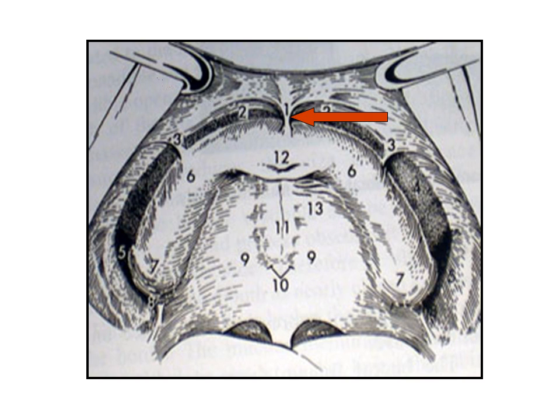The first of these is the labial frenum, followed by the labial vestibule, the buccal frenum, the buccal vestibule, the coronoid bulge, the residual alveolar ridge, the maxillary tuberosity, the hamular notch, the posterior palatal seal area, the fovea palatini, the median palatal raphe, the rugae, and the incisive papilla.